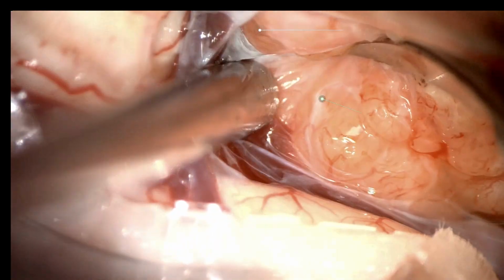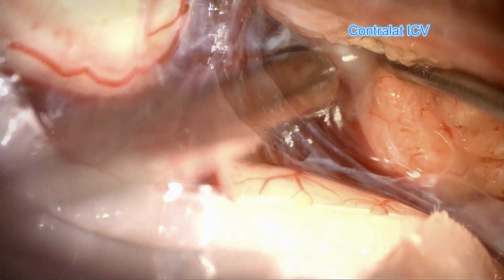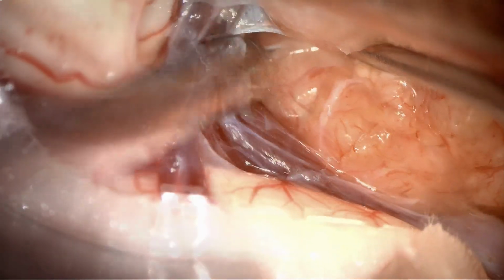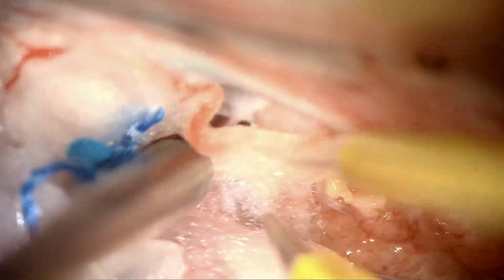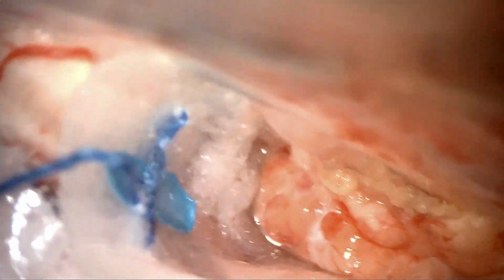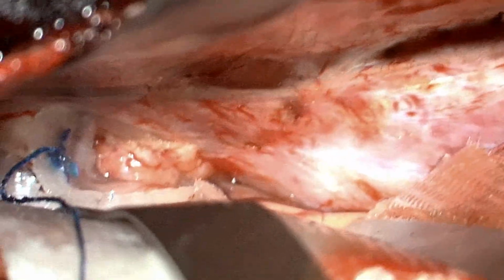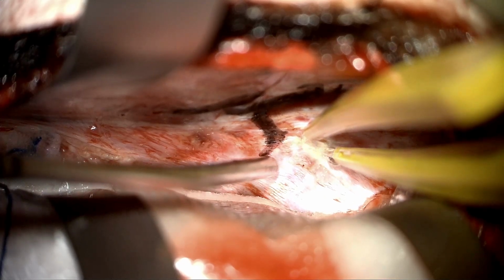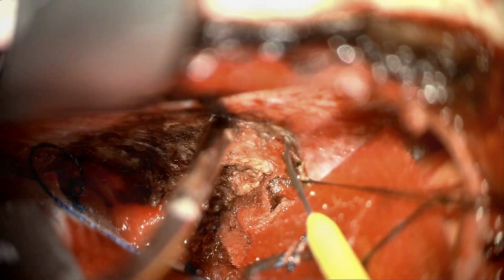Here we are seeing the internal cerebral vein and occipital vein from the other side. The goal here is to free the arachnoid adherence between the tumor capsule and the deep venous system. Once these structures are protected, the microscope is tilted backward towards the tentorium. The sinus rectus is visualized and mapped based on our prior coordinates. And once at this point, we proceed with the standard 4Ds of the meningiomas.